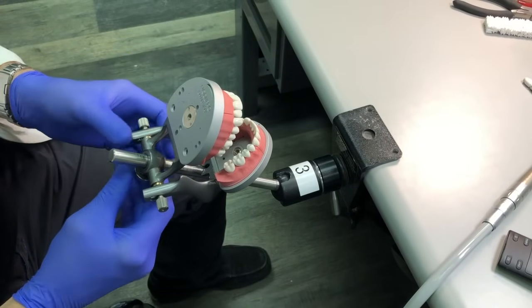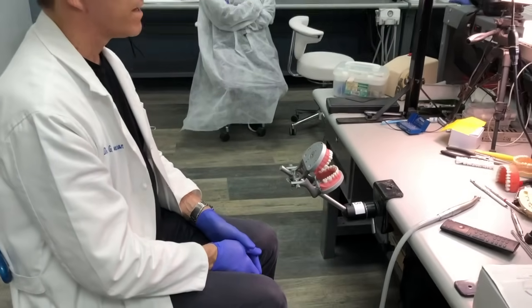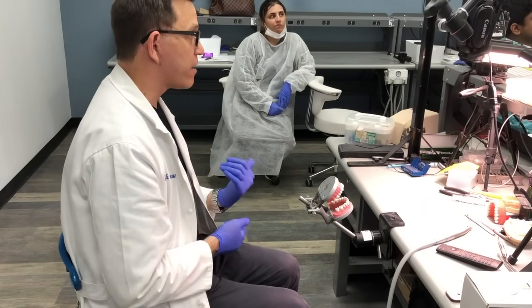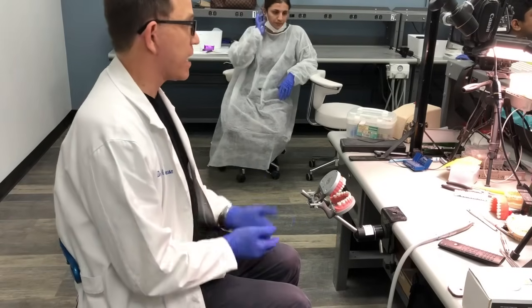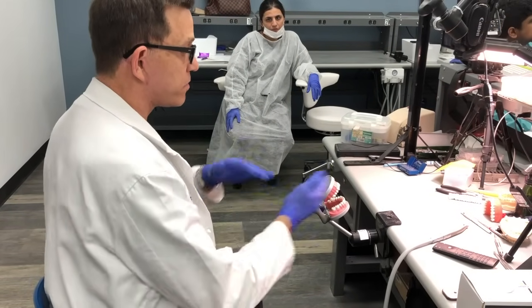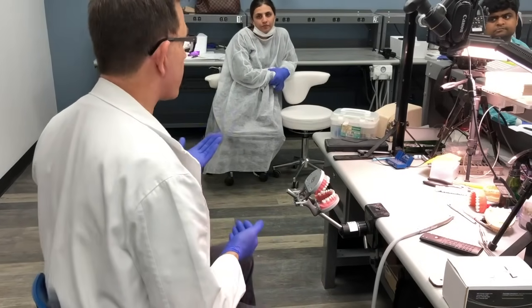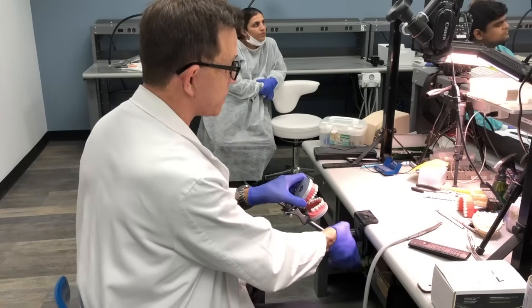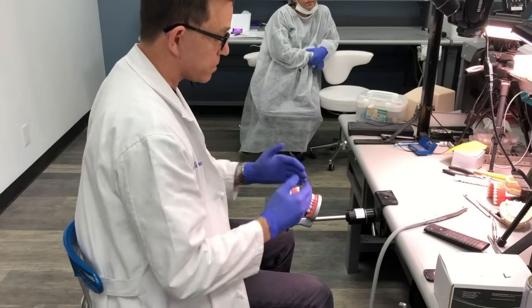Now let me show you the chair positions. Sitting right behind the patient is the 12 o'clock position, which is good for either left-handed or right-handed operators. The only problem is with a rear delivery system — then you have to stay at 11 o'clock. When discussing chair positions, we're mostly talking about right-handed operators, but for left-handed operators you just take the other side of the clock: 11 o'clock equals 1 o'clock, 9 equals 3, and 7 equals 5. Most procedures can be performed from 11 or 12 o'clock, but not always.